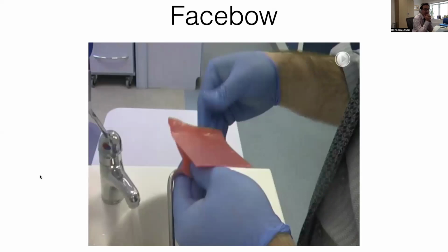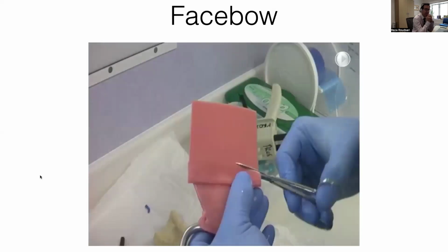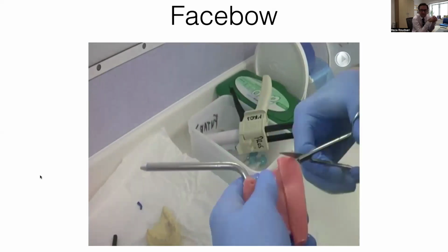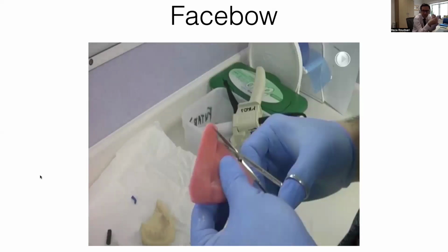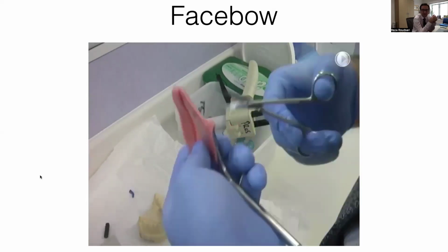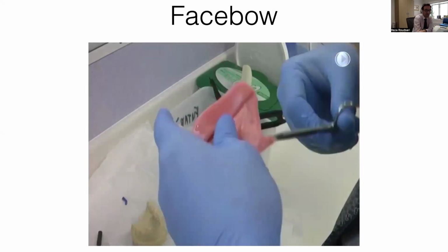Once you've laid the wax nicely and removed any excess, you soften the wax, and then you go in the patient's mouth. As I said, the whole video is available on YouTube. Please go and watch it, because you also have commentary to explain how it is done. I will also put a link to this video on your Blackboard, so you can watch it in detail.